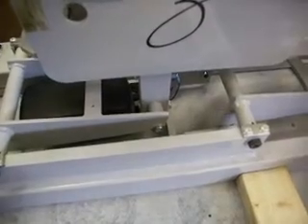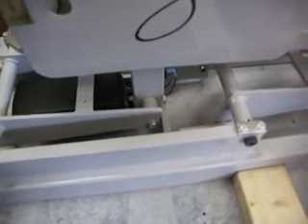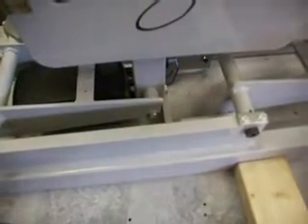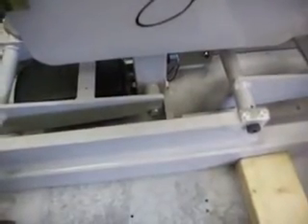The instructions we'll provide here will enable individuals to raise the table to a working height, and at that working height then follow the instructions for the removal of the linear actuator that's found in another instructional video.